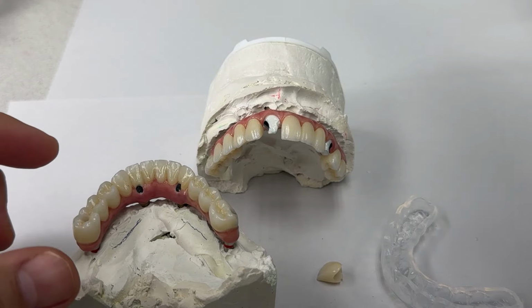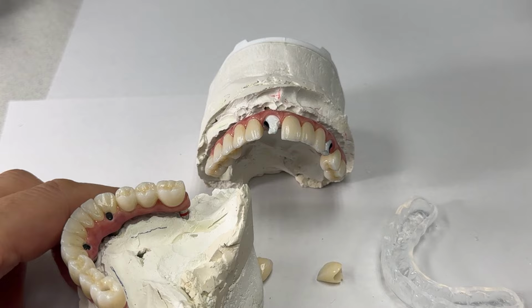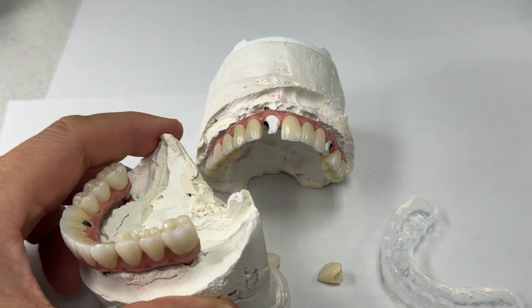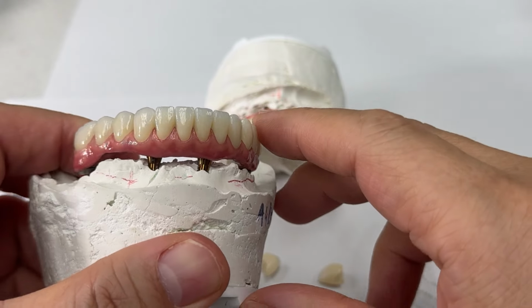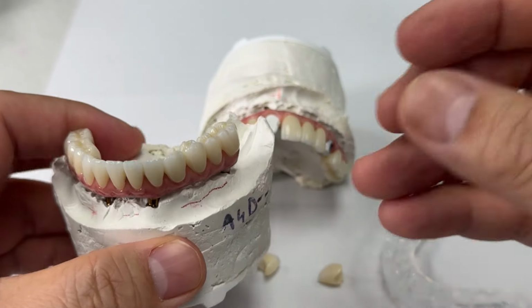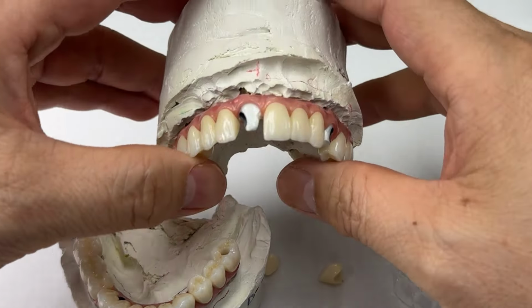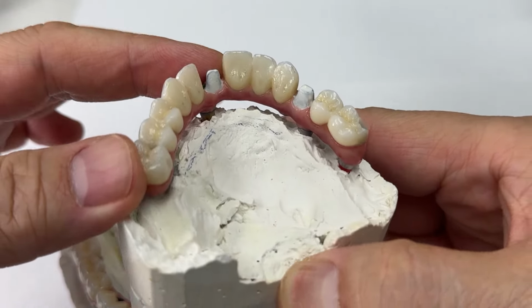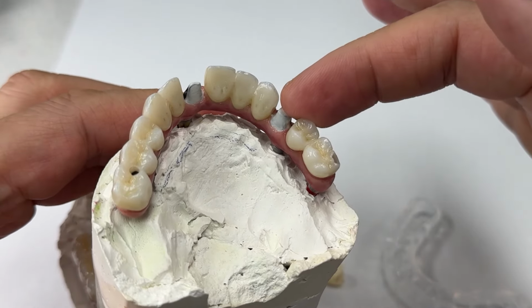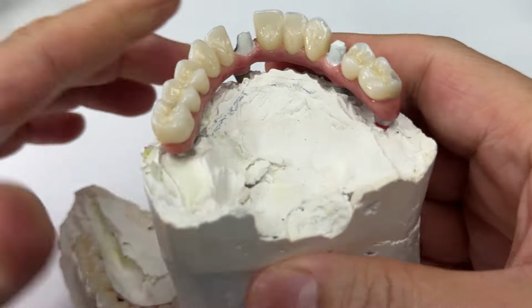Okay, so after cementation, if you want to see more of my cement procedure processing, I made a lot of previous videos on YouTube, you can check on it, or you can see it on my YouTube membership or Patreon membership. So like I said, this is the extremely large one, and then we make the very thin chrome cobalt, which you've never seen before.